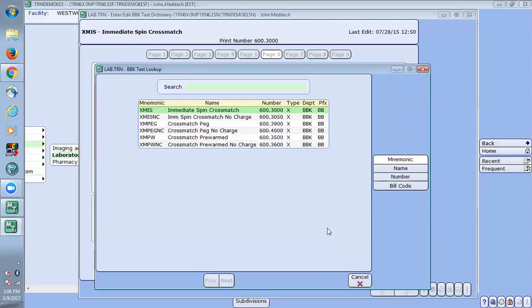I believe this enhancement came about with LIT 1707. There are quite a few other LITs associated to this. So if anyone would like information related to that enhancement, please just let us know, and we can provide the associated link.